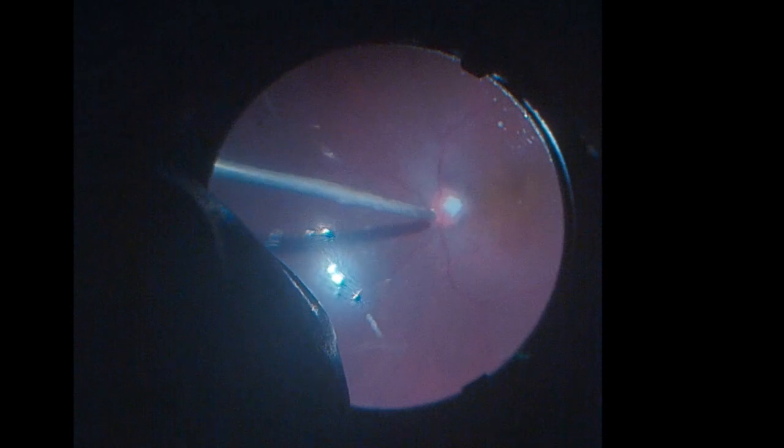We can see residual fluid getting collected at the dependent position, which was aspirated through the cutter.